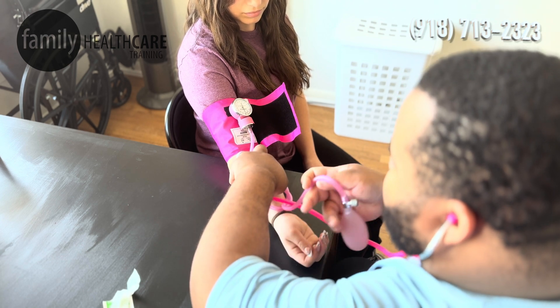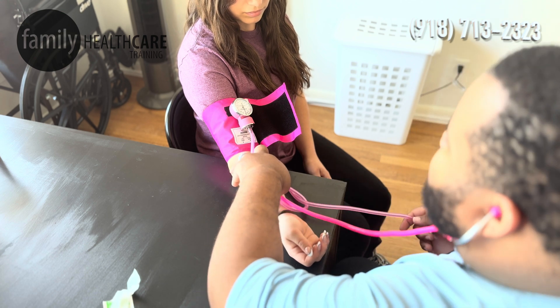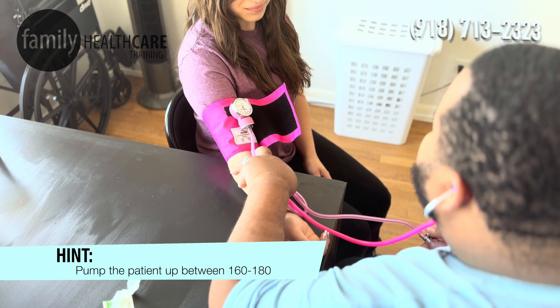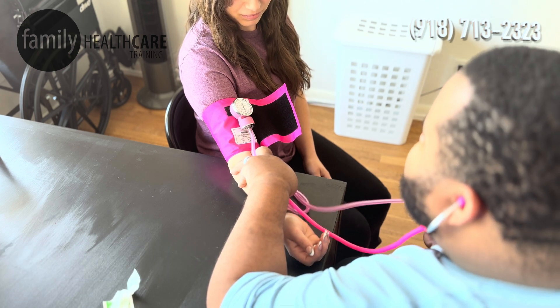When we pump up our patient, we want to pump them up — as long as their blood pressure is normal — between 160 and 180. Miss Ashley, do you have normal blood pressure? Yes. Perfect. Alright.